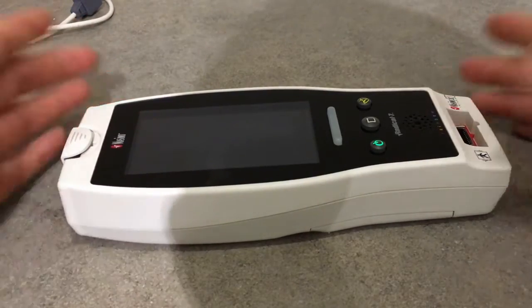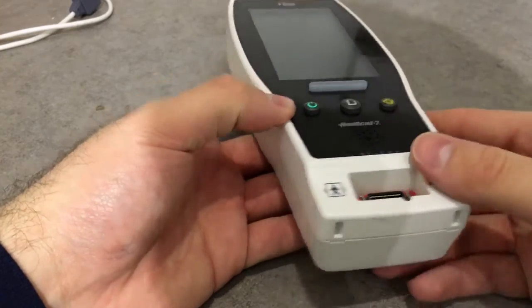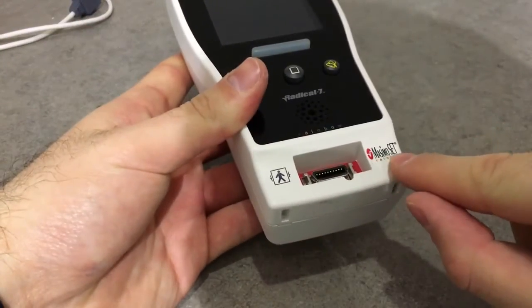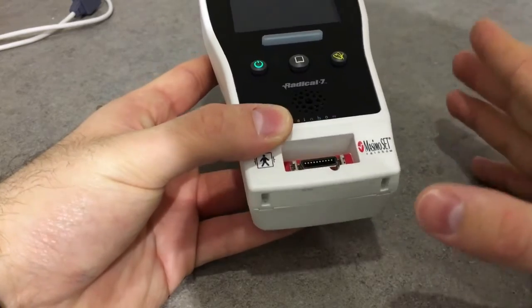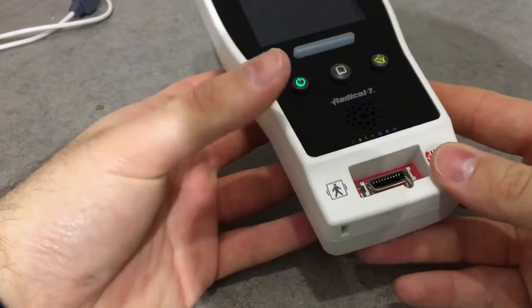Welcome to another AVA equipment video review. Today we're going to review the Masimo Radical 7 Pulse Oximeter. This is a very advanced device. It uses the Masimo SET — Signal Extraction Technology — which uses five parallel engines or algorithms to calculate SpO2.